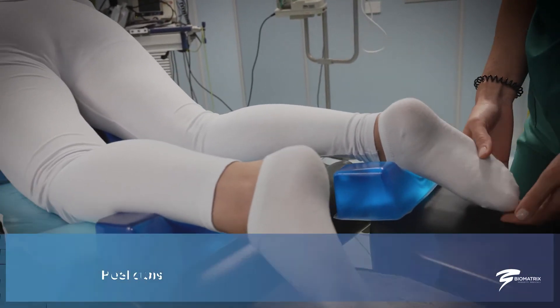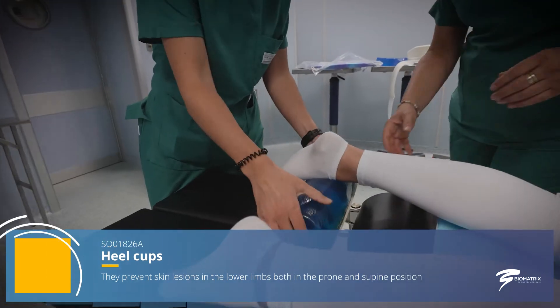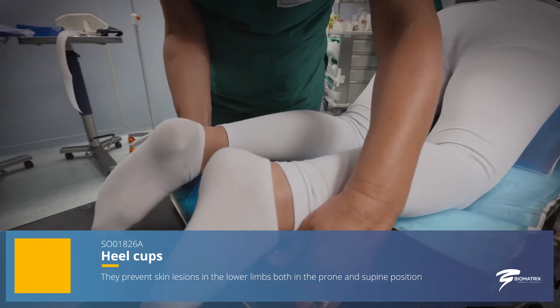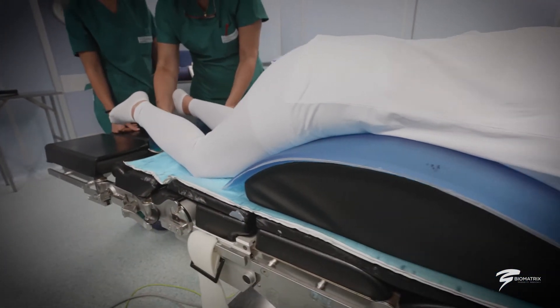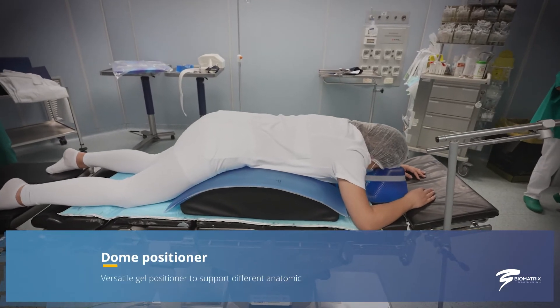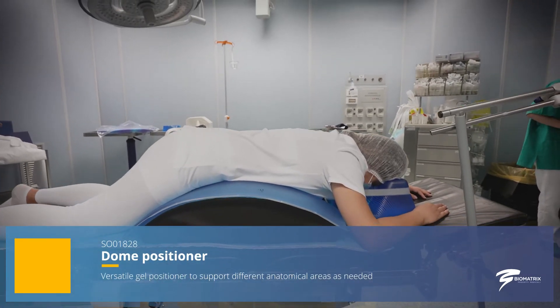These devices are latex-free, radiolucent, and antibacterial. They have water-repellent capacity, maintain their hardness over time, and are easily sanitized. They are isothermal and can be combined with heating or cooling mattresses.